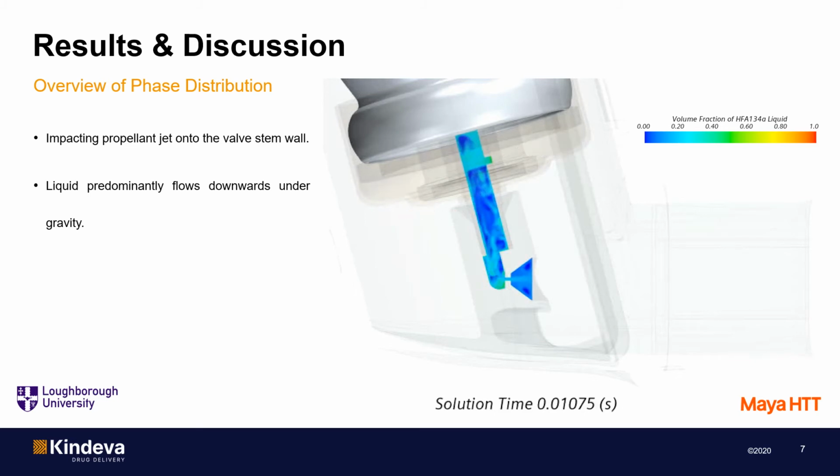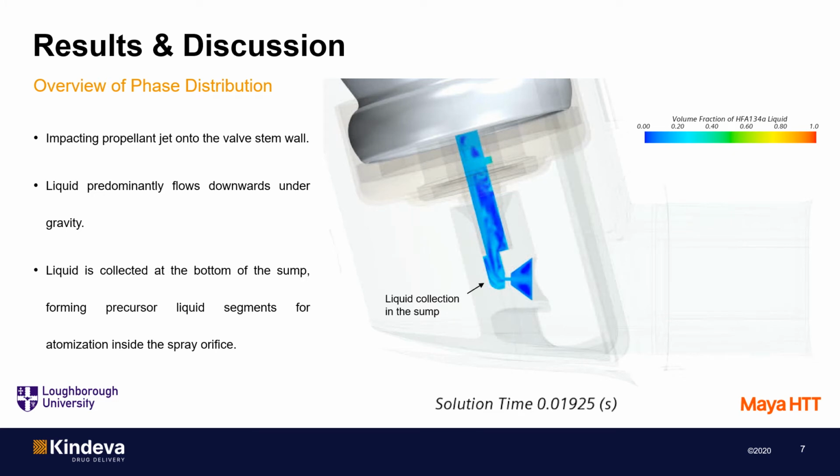Vapor mainly flows through the central region of the expansion chamber, making a vapor-rich core. The force of gravity causes liquid to drain down the walls of the expansion chamber and to make its way to the actuator sump, which is enriched in liquid.